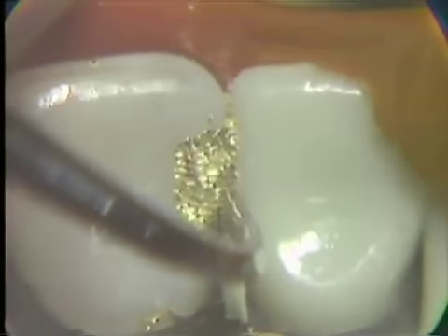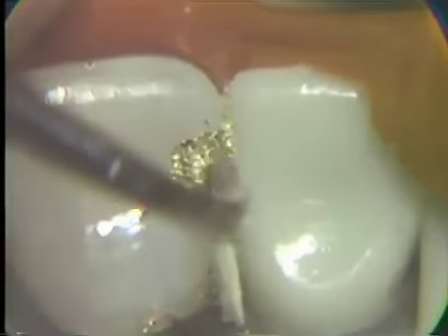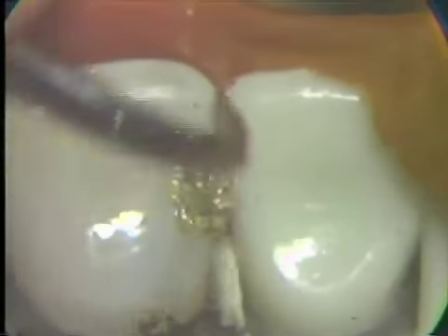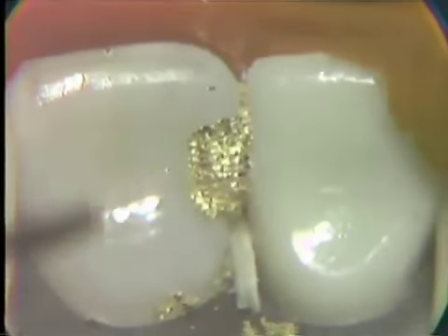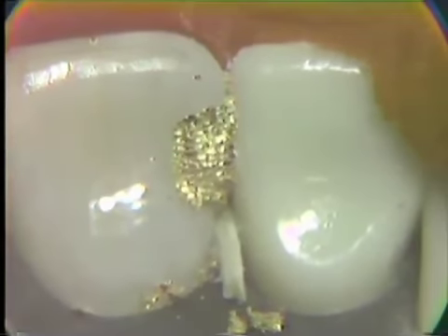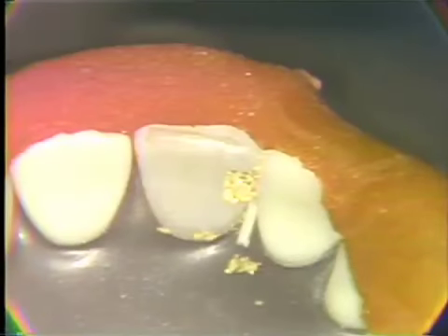As we view this now, we want to make sure, of course, that we have sufficient excess of gold in order that we can establish the contour that we want. And by viewing this from different angles, we see indeed that we do have this contour established with the condensed material, and we're ready then to proceed.